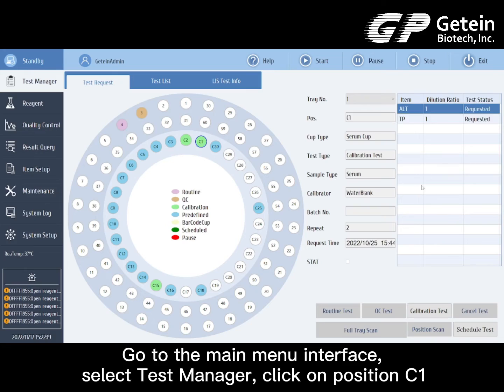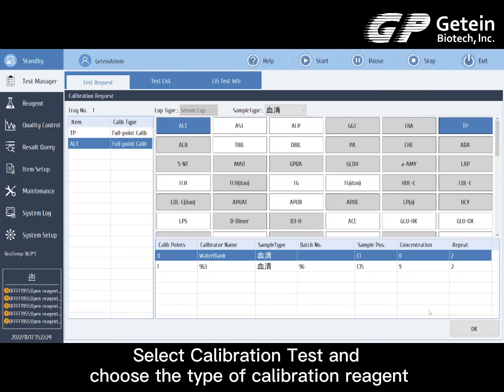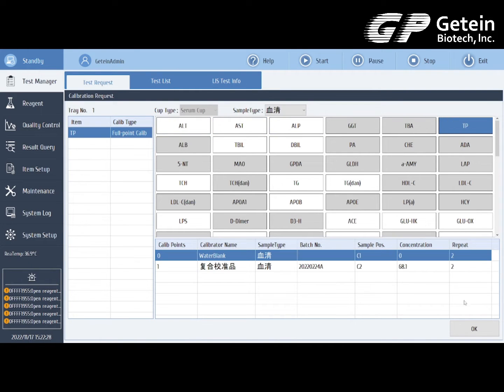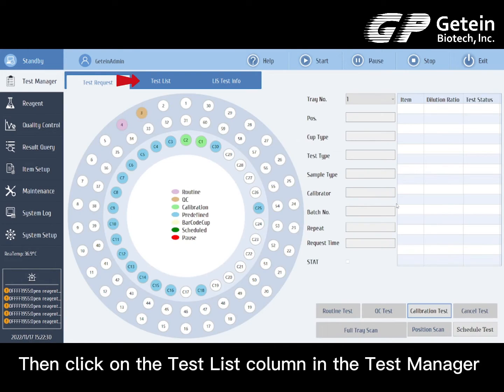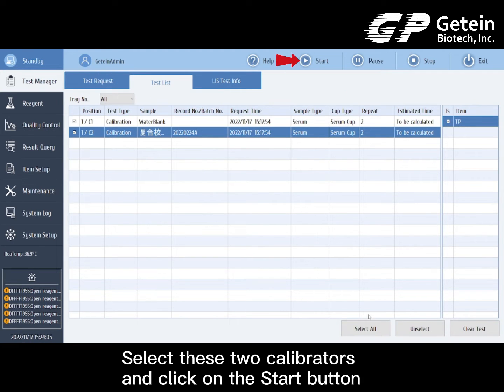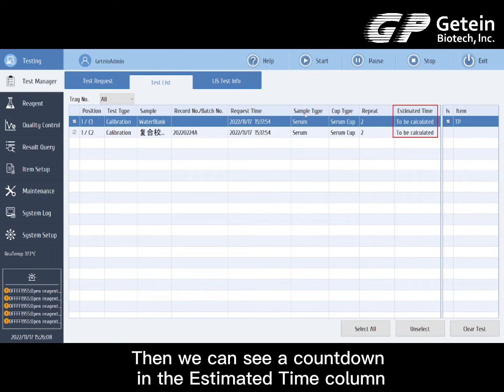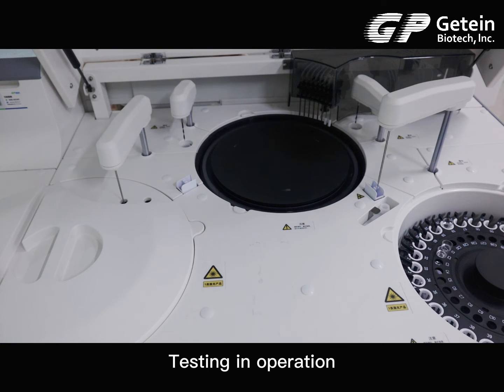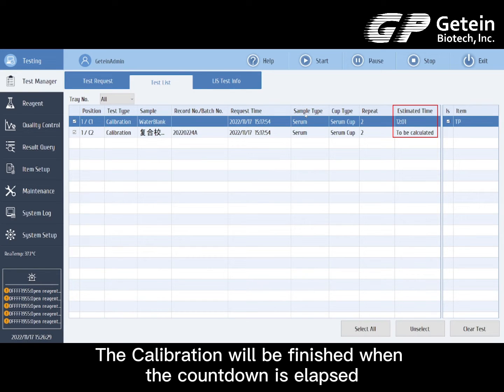Go to the main menu interface and select test manager. Click on position C1, select calibration test, and choose the type of calibration reagent. Then click on the test list column in the test manager, select these two calibrators, and click the start button. A countdown will appear in the estimated time column. Testing is in operation and the calibration will be finished when the countdown is elapsed.